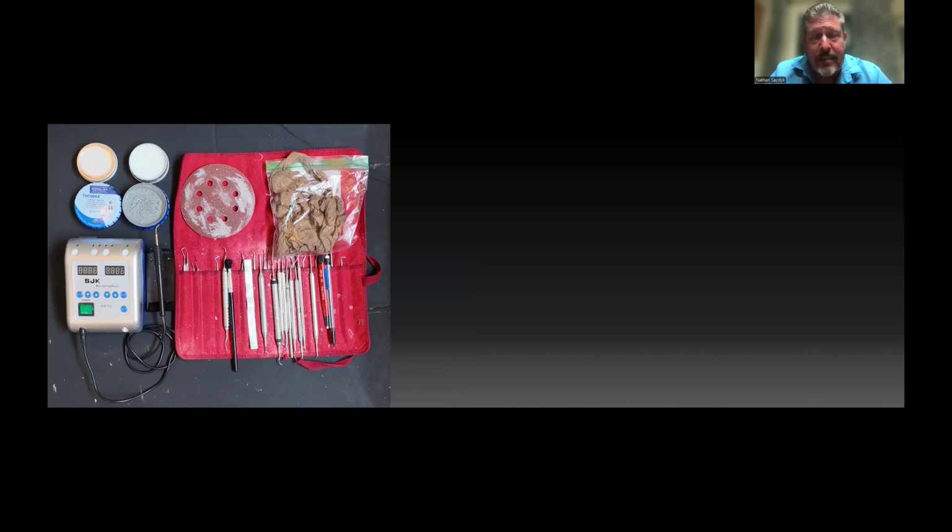I like gray wax, not the white wax. If you have white stone, wax it up gray. If you have gray stone, wax it up white. You want to be able to see where your wax is beginning and ending on these cases so that you know you have positive seats, right?